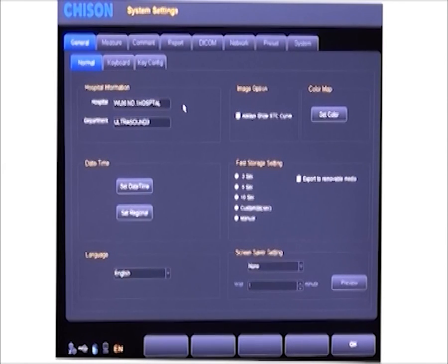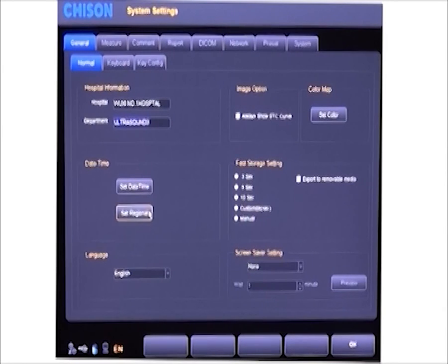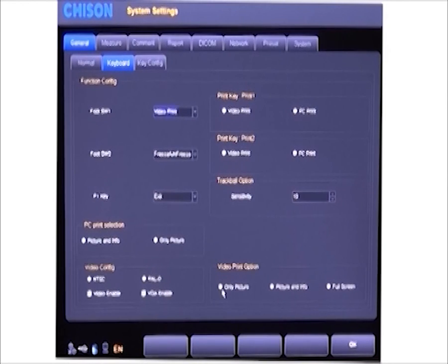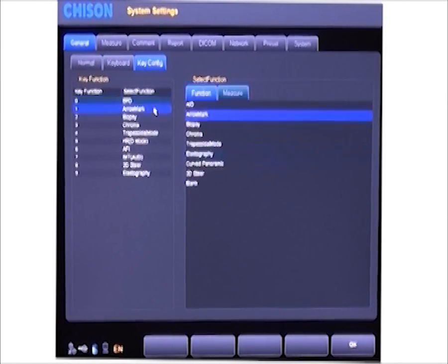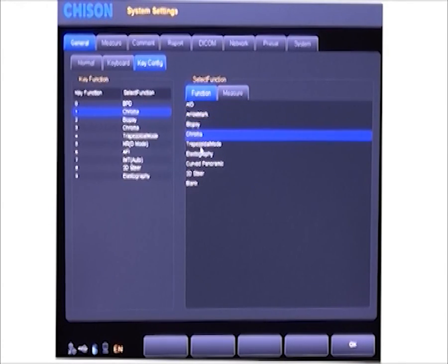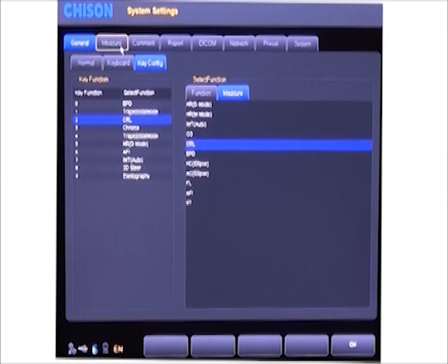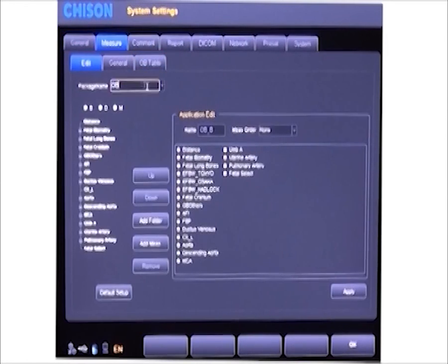We can input hospital information here. Different regions may be in different time zones, so we can use regional settings. There is a printer key on the keyboard — we can define its function here as video printer or PC printer. We can also choose the print area. Here is the key configuration, which we call hotkey function. You can redefine different functions or OB measurements from numbers 0 to 9, which saves doctors a lot of time. Different applications have different calculation packages — we can choose the method we want.